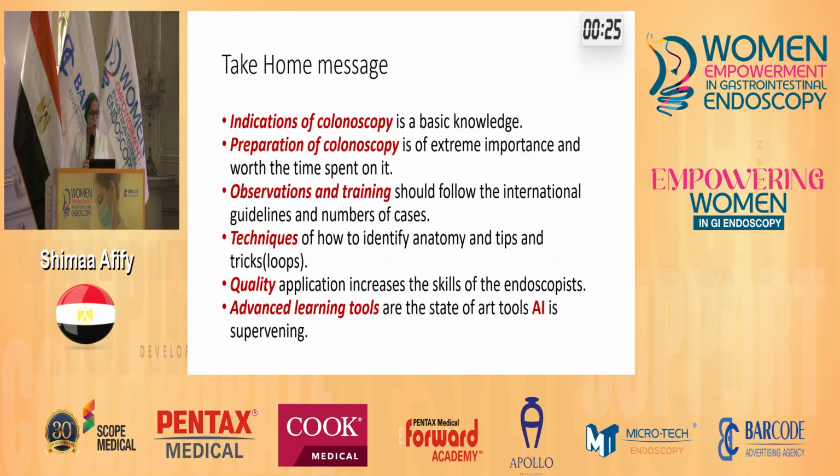Our take-home messages today, going back to our agenda that we have already covered: Indications for colonoscopy are basic knowledge. Preparation for colonoscopy is extremely important and worth the time spent on it. Don't make it speedy or skip spending time on it. Observation and training should follow international guidelines and number of cases.